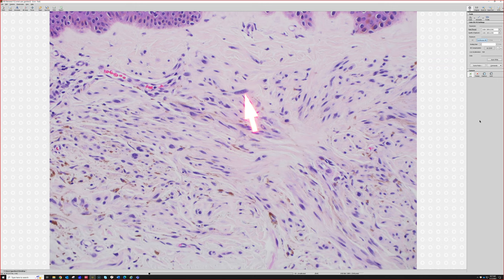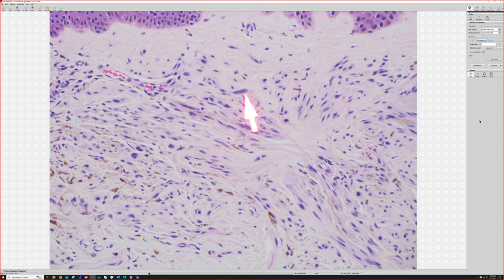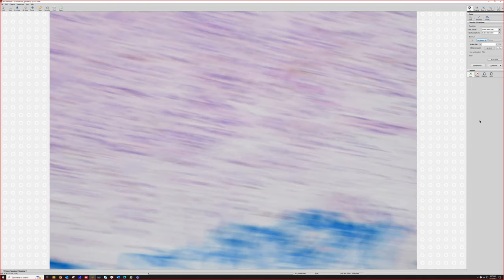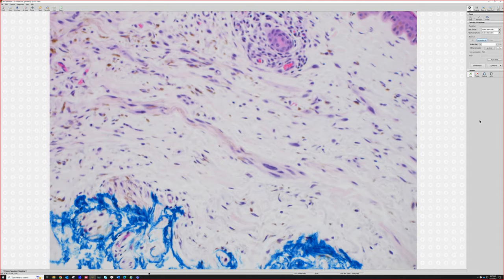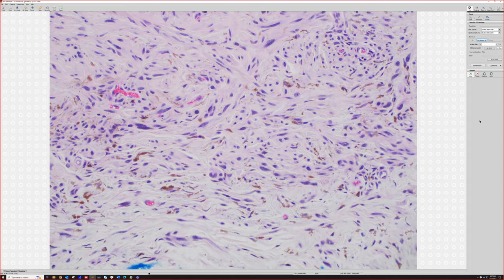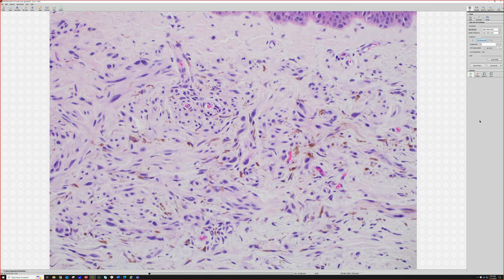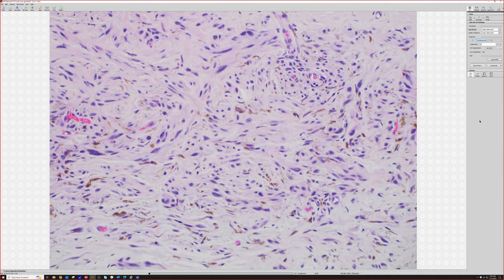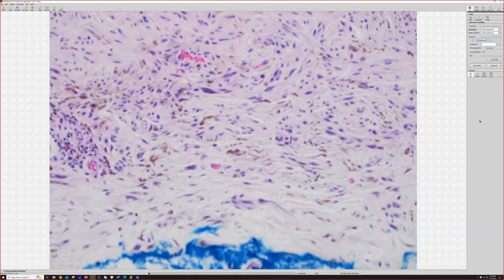Again, in real life, there is a little more complexity than that, but for practical purposes, it is usually going to be benign if everything else looks normal about the nevus, a random enlarged hyperchromatic cell in a conventional, a regular nevus or in a blue nevus, okay? It's okay to have occasional enlarged cells. I usually do look a little closer at blue nevi in older sun-damaged adults just to make sure that I don't see mitotic activity or really wild, more diffuse atypia, because there are some melanomas that can mimic blue nevus. And of course, additional workup can be done depending on the particulars of each individual case.